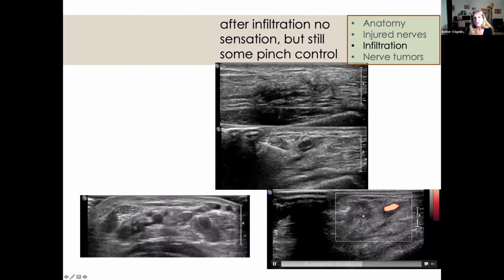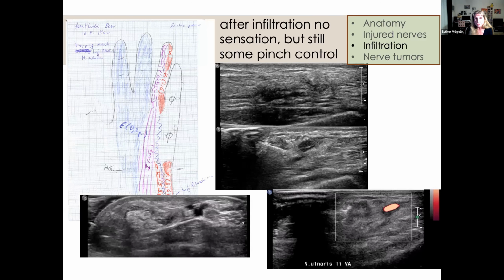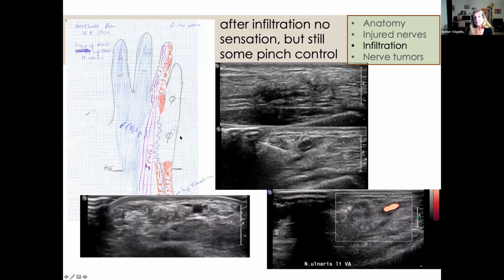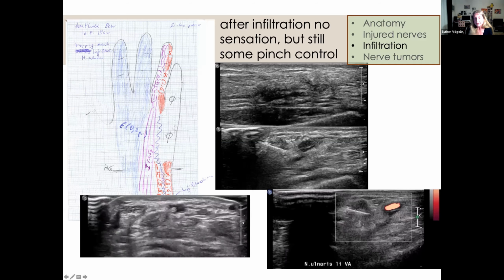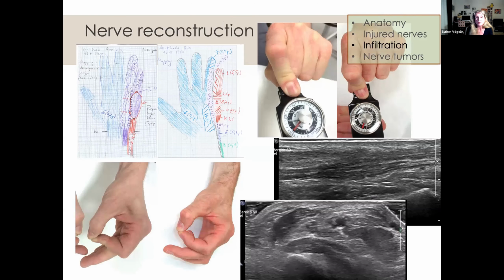After infiltration, this patient had no sensation, but still some pinch control. You see here the mapping again, no more sensation. So you must have some median nerve innervation of his intrinsics that gives you more confidence to do whatever you want to do, a reconstructive procedure again.